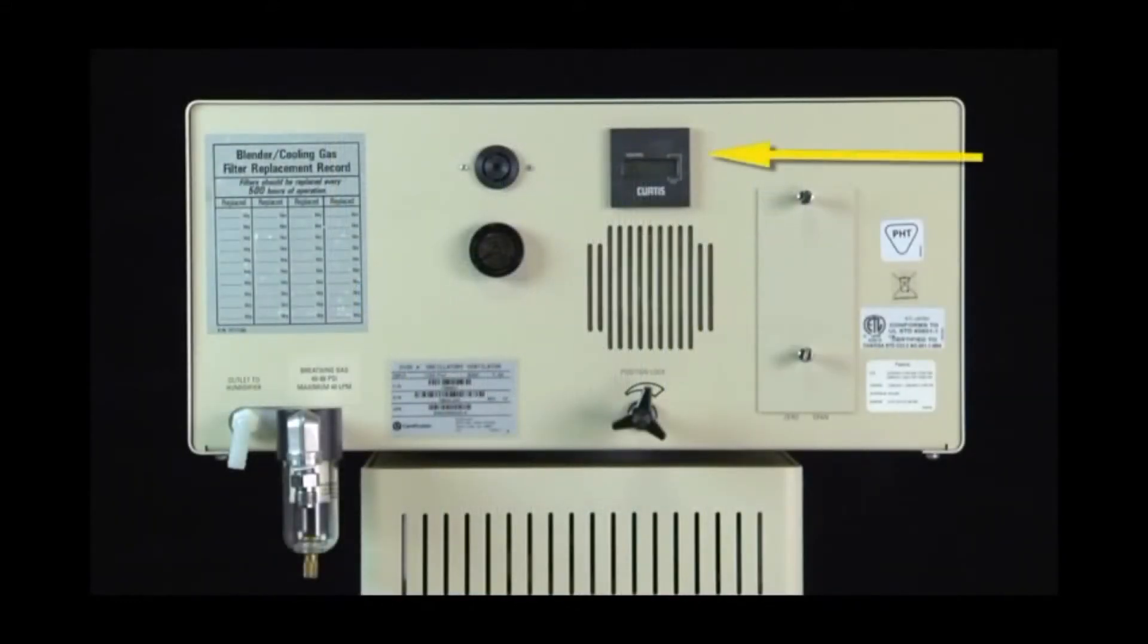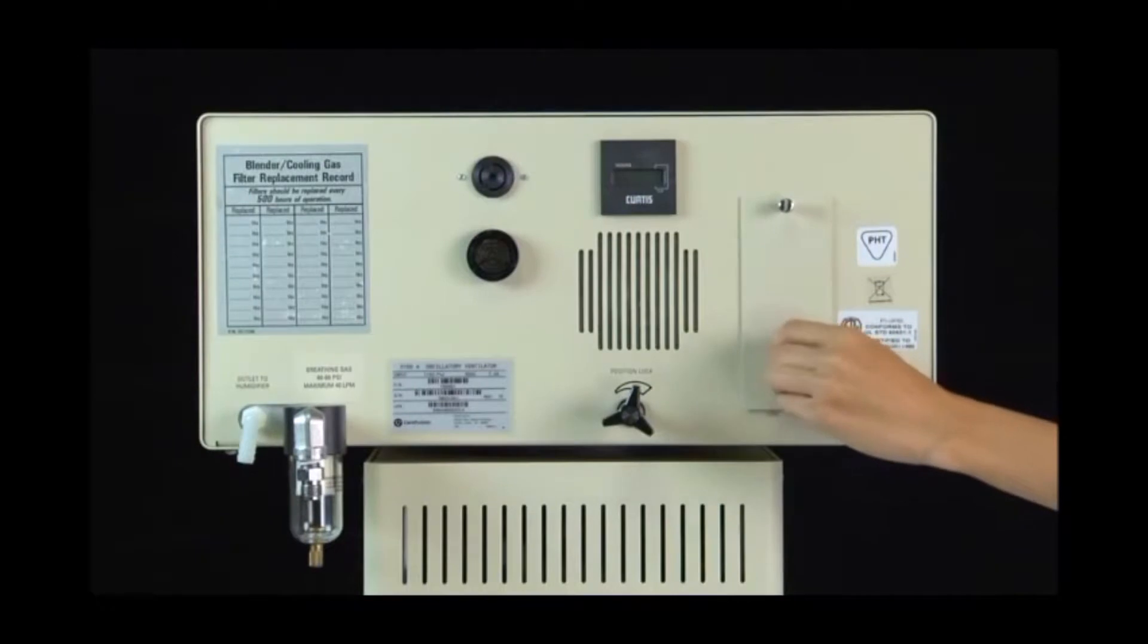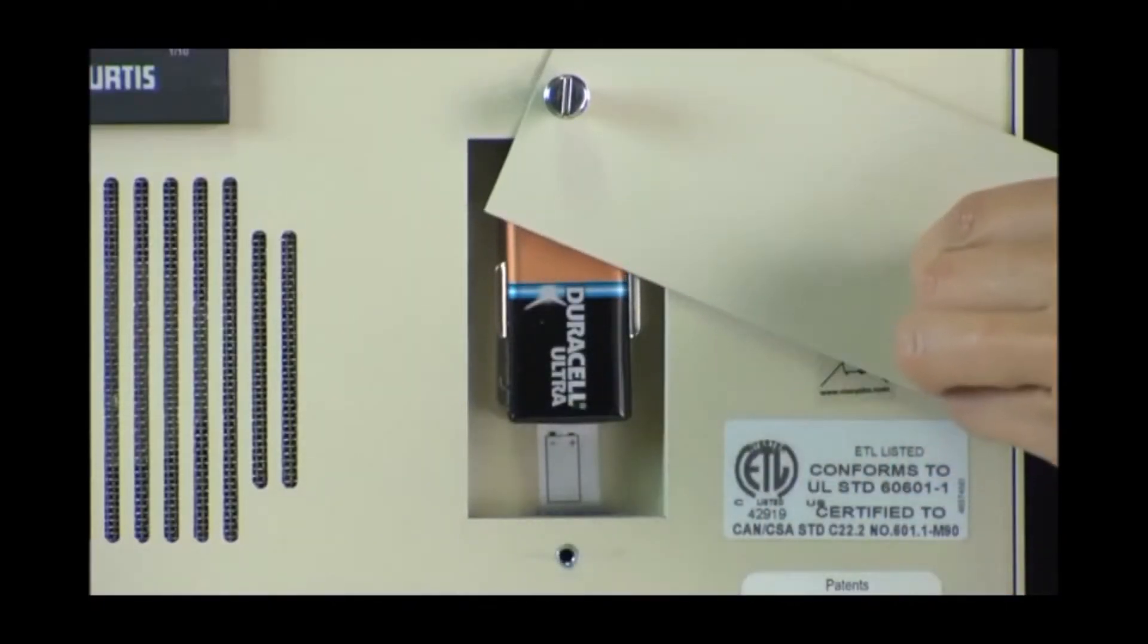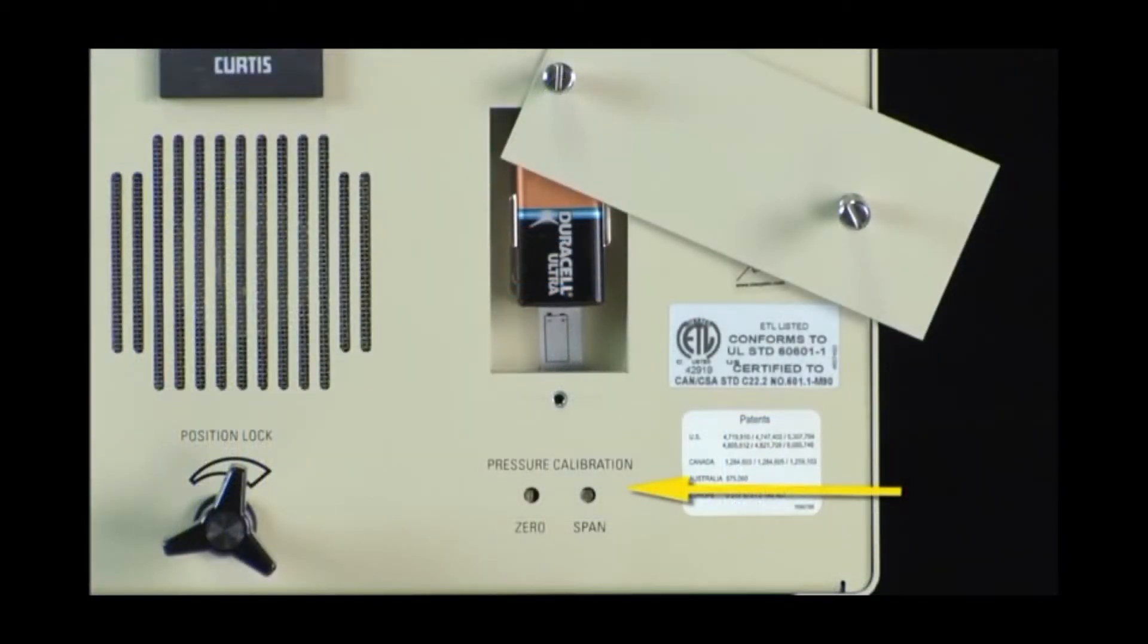The elapsed time meter indicates the total time in hours that the ventilator has been in use. This compartment houses a 9-volt alkaline battery, which powers an audible alarm in the event of power loss to the instrument. The adjustment points for calibration of the airway pressure monitor transducer are located here. You should refer to the instructions included in your service manual for this calibration procedure.